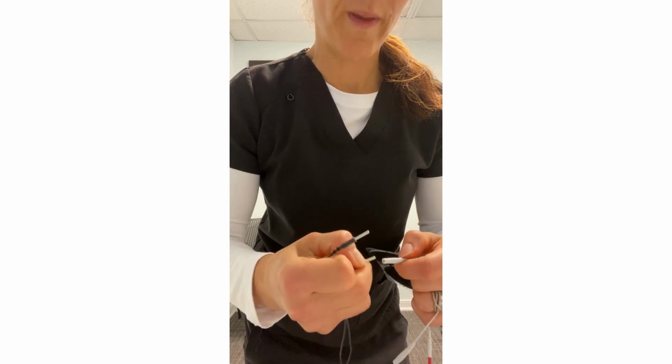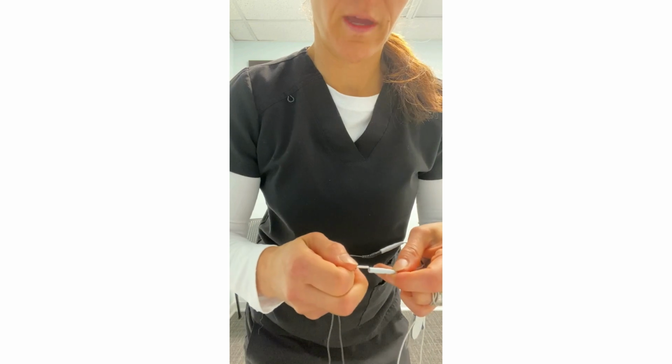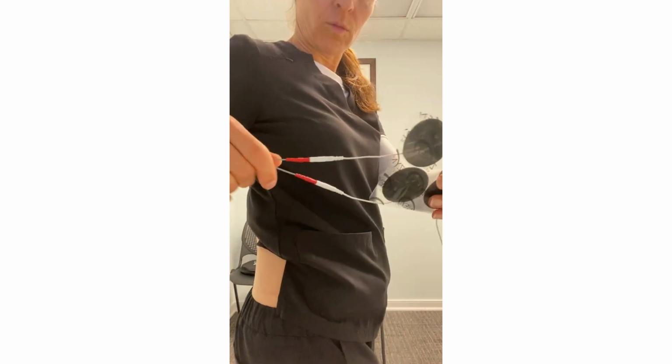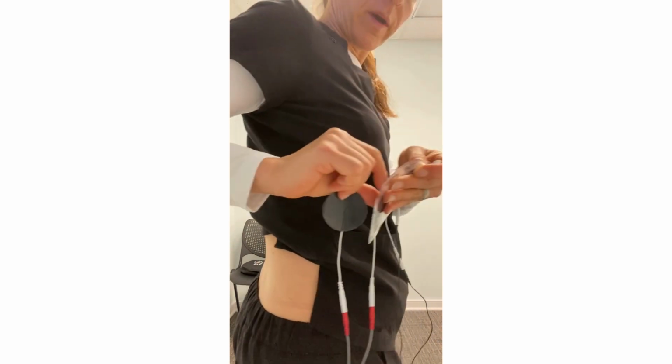Remember, we're going to go parallel to the spine, and this is for a common low back pattern, but really wherever the pain is, you're going to put the pads just above and just below. So that's going to treat the area. So we'll start with the red leads first, and I'll pull both off by the pad, not by the wire.